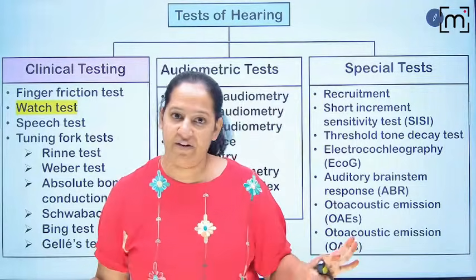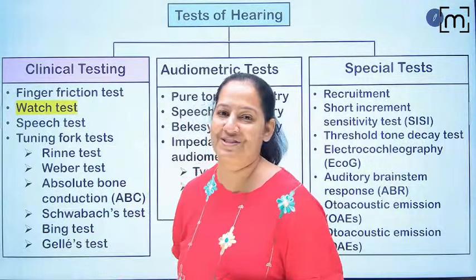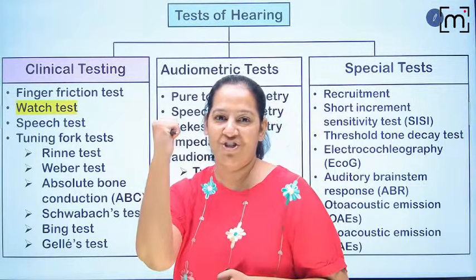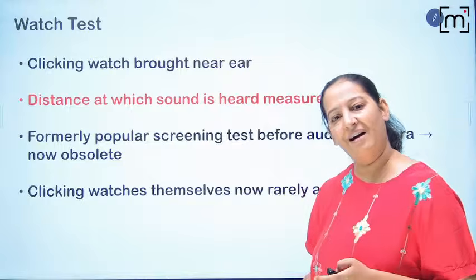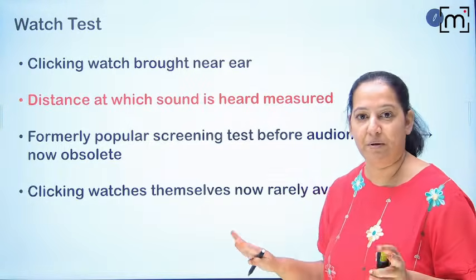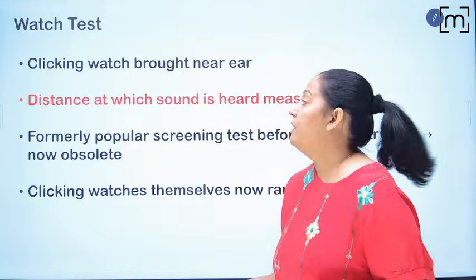I will teach you each and every test, whether it's minor or major. Coming on the second test: the watch test. I don't have it, but watch test. So what we are doing, again obsoleted nowadays, nobody performs, but for historical purpose you should know.